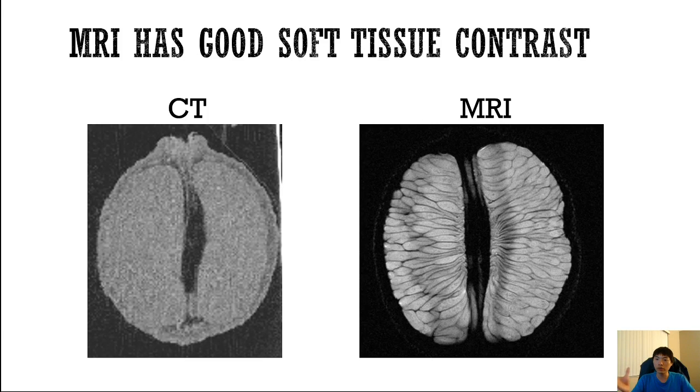So these are kind of the two contrasting factors in terms of deciding which one to use, because they're both three-dimensional imaging modalities. But the CT, for example, because of the risk of radiation damage to the DNA, is usually not recommended for, for example, mothers who are pregnant, and also younger patients, because there's a greater lifetime risk of cancer if you expose younger patients to ionizing radiation.